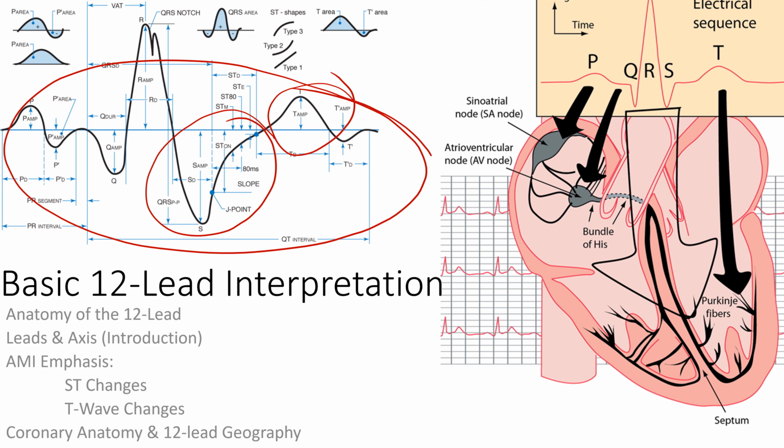Okay, you've seen those intervals before. This is from a monitoring company, so that uses AI to figure out if there is a change in ST segment or T wave amplitude or P wave amplitude, P wave area under the curve. It assesses that well before a human ever could. It says, hey, you got a 10% change in your ST segment, or your PR is getting prolonged. It would then output that for you. So that's the nice thing about that.